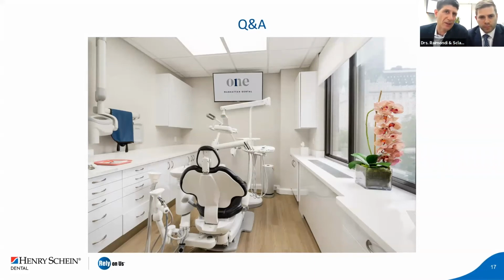There are times that you have to take it out of the patient's mouth, when they raise their hand, they want to rinse out, and it's just pulling it out and placing it back in. It's not a big deal at all. It's easier than you think it'd be, right? It really is. All right, so that wraps up.